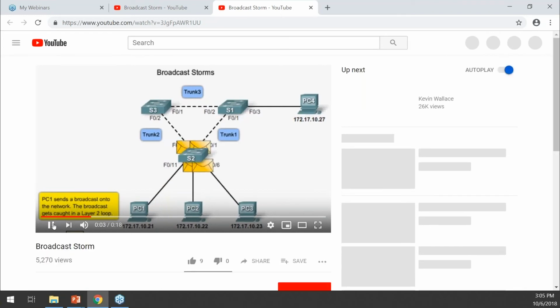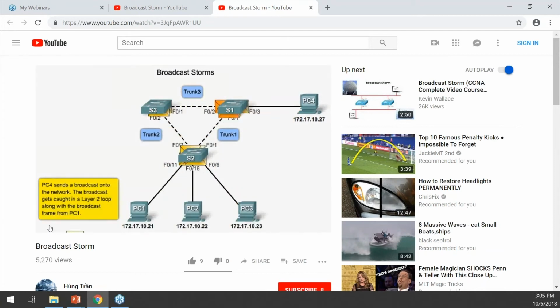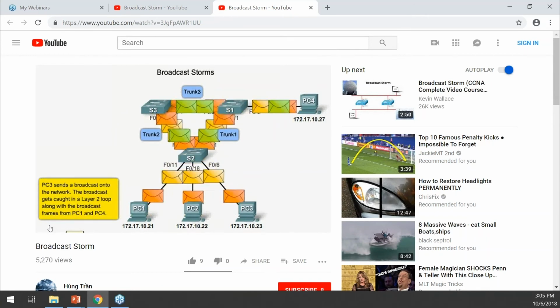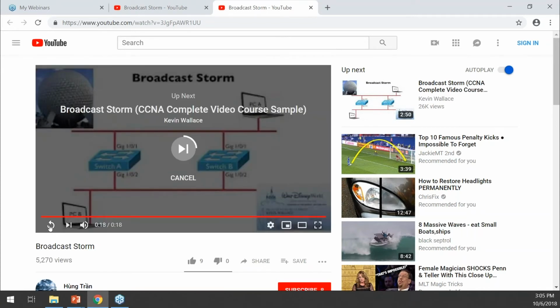I paused it. Okay. So there it is. You saw the first messages going out. They're hitting a switch. And now this guy is not going to throw things away. He's going to keep replicating. And you can see different versions of things going out. And now all of a sudden, oh, wow, everything's getting slow. Hey, the monitoring stopped working. And pretty soon it's so full that all of your interfaces are completely saturated and nothing's happening except forwarding those broadcast packets around. It's a bad thing.